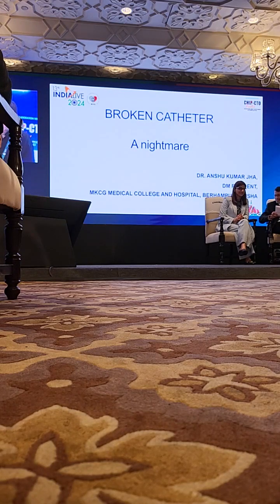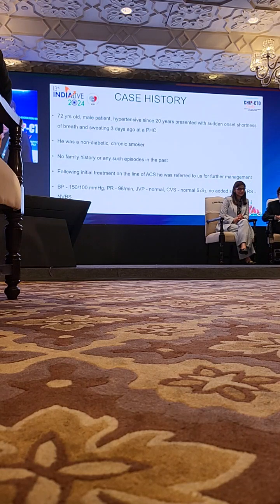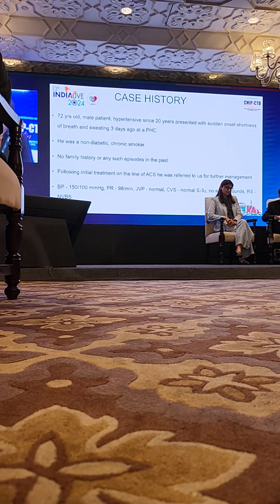So, this is a case of a broken catheter during angiography. This was a 72-year-old male patient, hypertensive for the past 20 years, who presented to us with sudden onset of shortness of breath and sweating 3 days ago at a PHC. He was non-diabetic but a chronic smoker. No family history or any such episode in the past. Following initial treatment by the PHC doctor on the lines of ACS, he was referred to us.